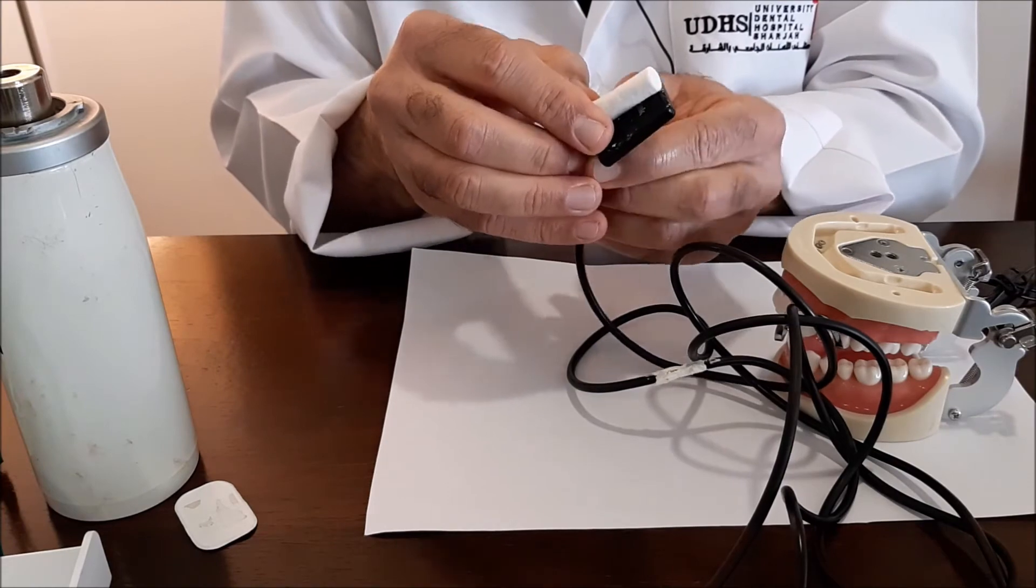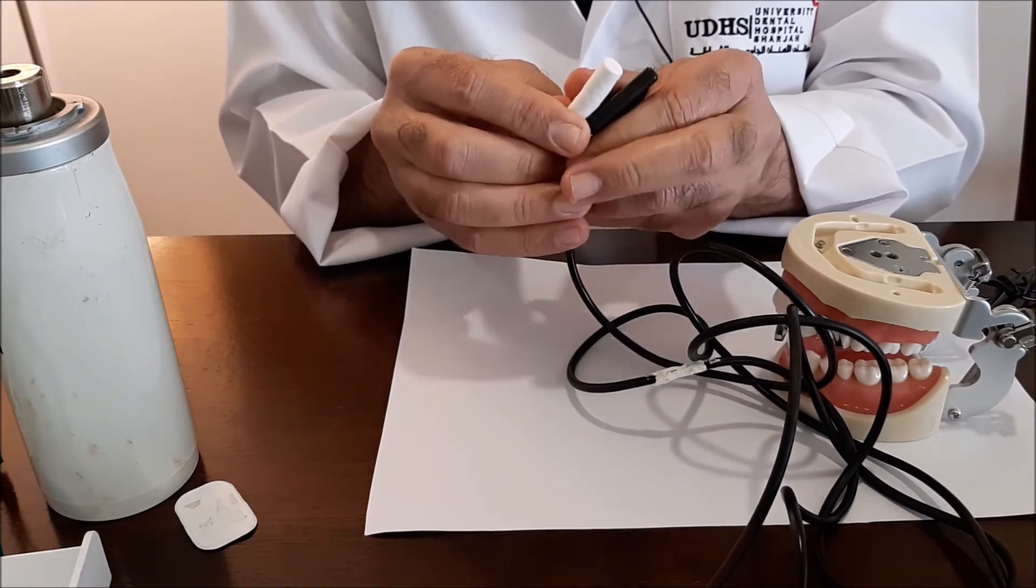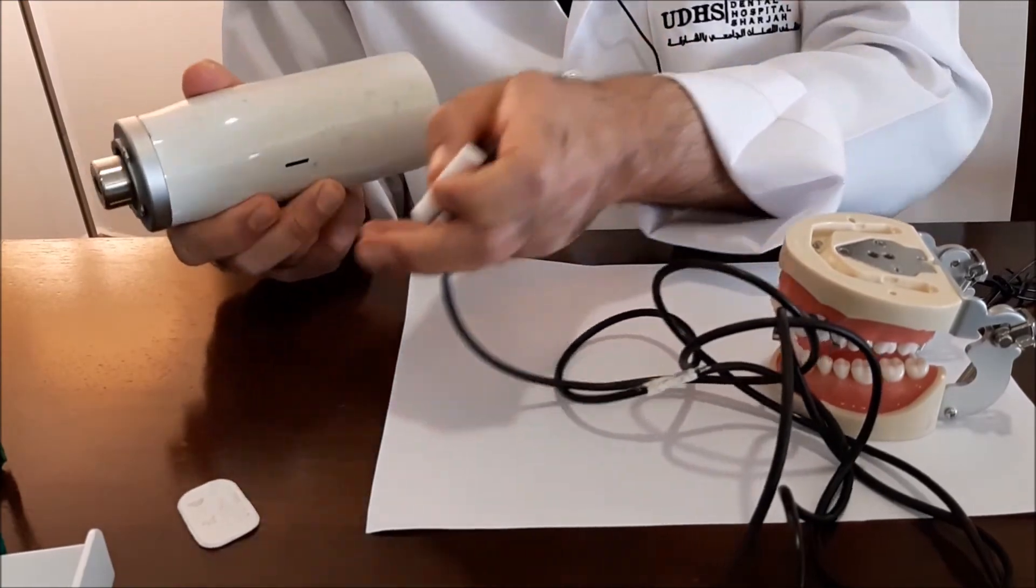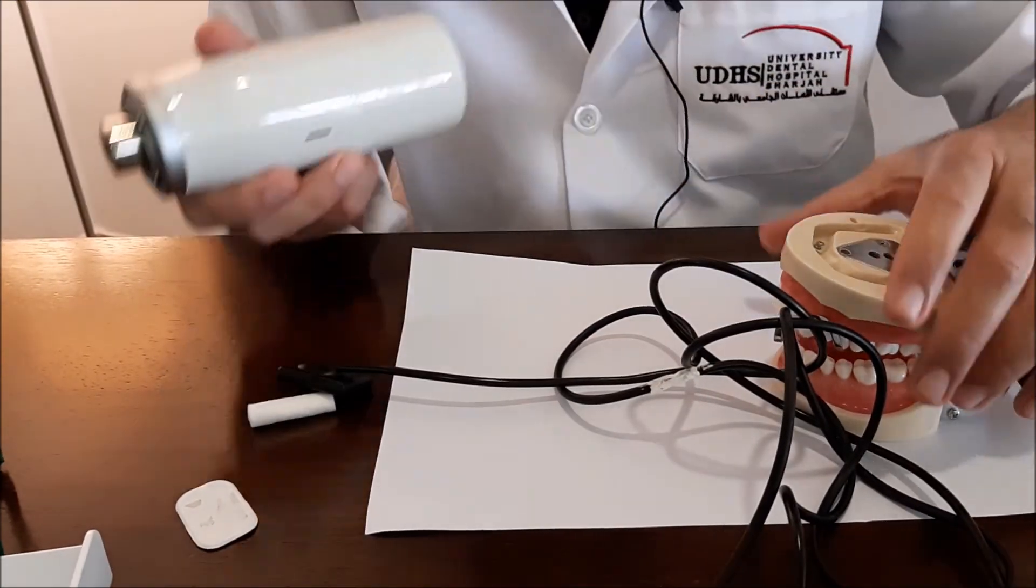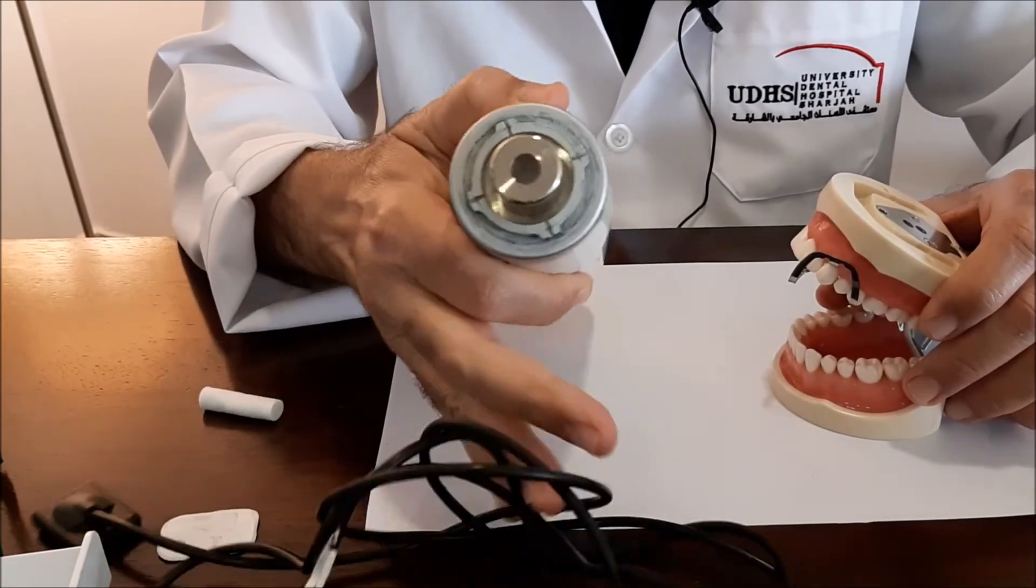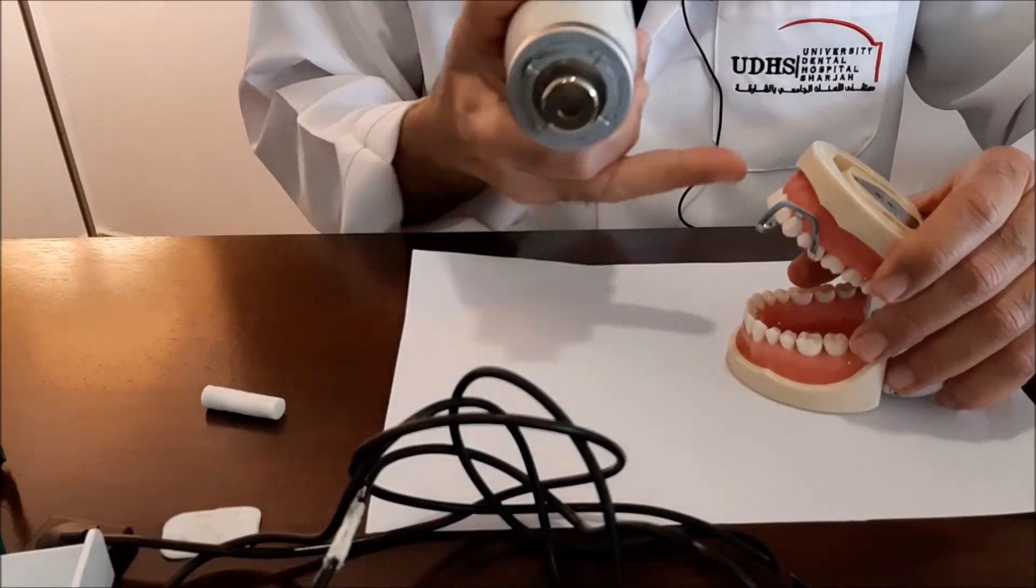When you place a cotton roll, you are going to reduce it so that you will compensate by the movement according to the angle which is formed between the tooth and the sensor.